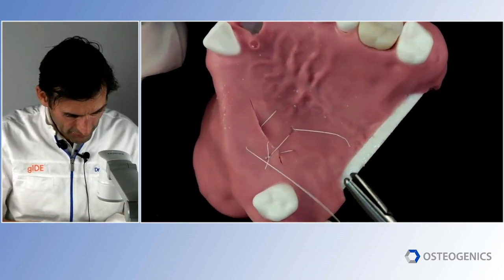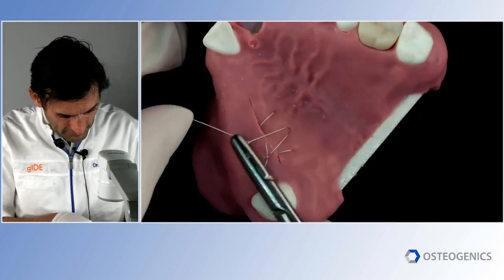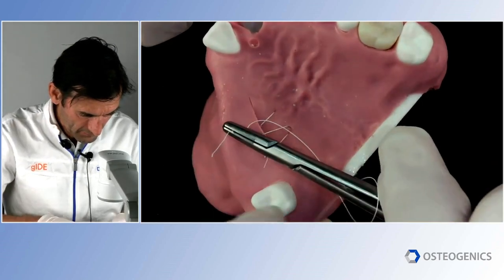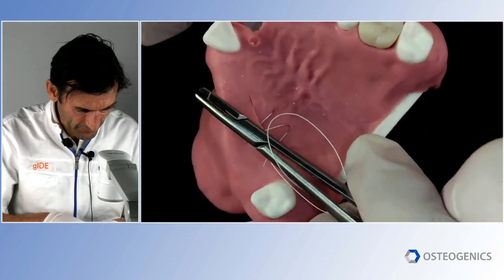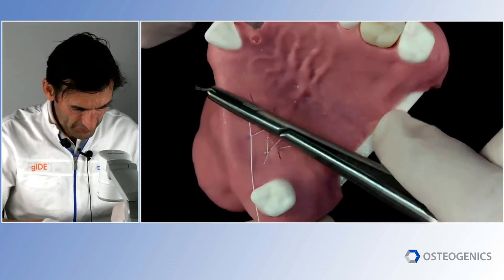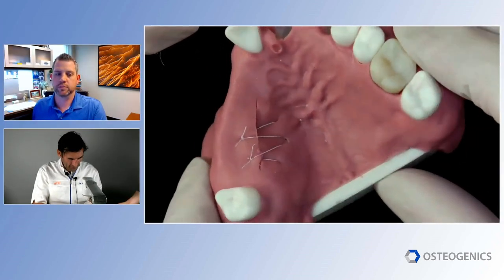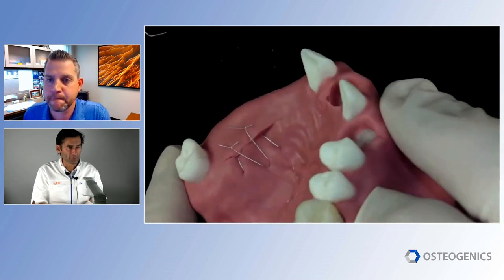Now look, now I'm going to close it again, two knots. And same. And actually, it's very nicely visible here in this hands-on demo. Three knots and four knots. Okay. And then cut. Okay. Now I see the two. And in a patient, I would do a third one.